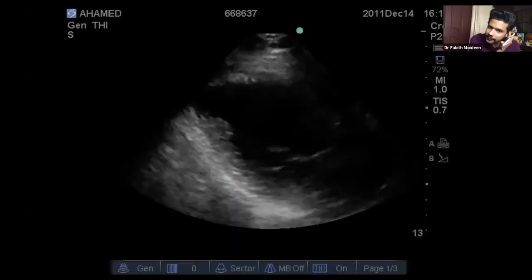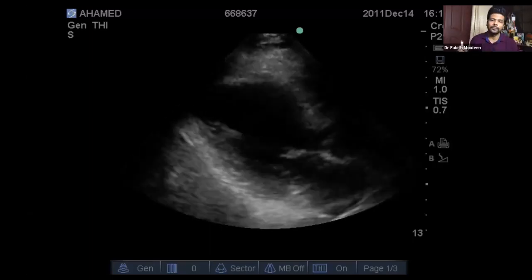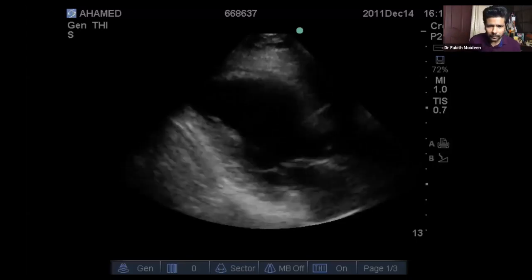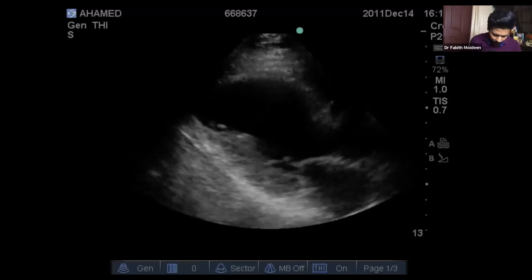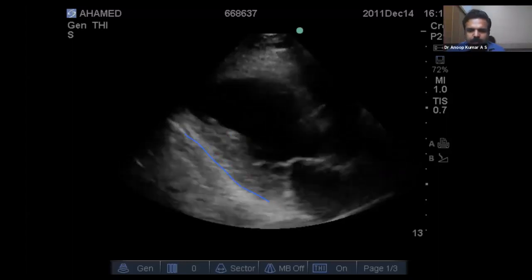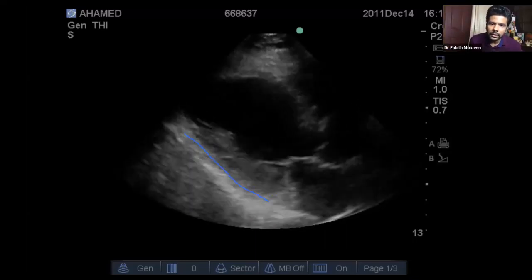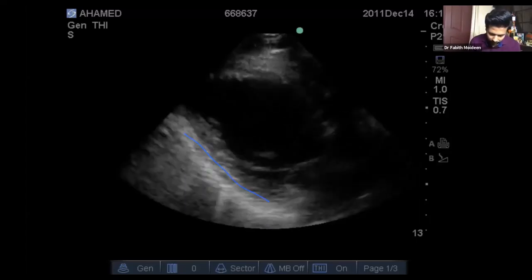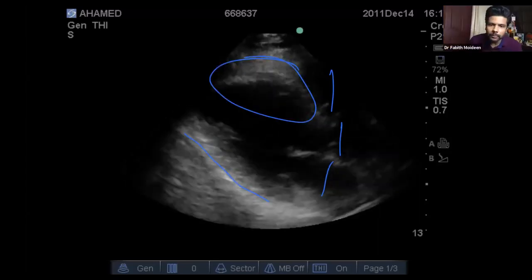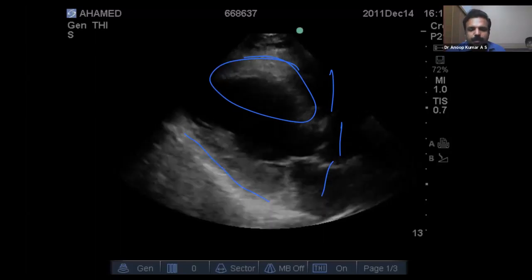Okay, so this is the second case. Parasternal long axis, you'll agree with me. The problem is, I'll give you 1 minute for that. Again, there is no fluid around the heart. In the chat, you can keep typing. Okay, so there is no fluid around the heart. Okay, very good. And then rule of 3. People are typing. Very good. There is the rule of 2 problem, that is septal hypokinesia. Okay, agreed. You want to comment something on that?